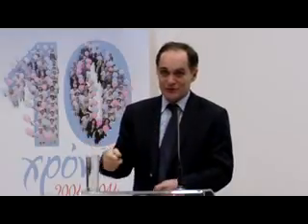Now, more and more, based on the studies of laparoscopy and major surgery, where you really remove as much as possible, you see that it improves. So now also with hysteroscopy, the size does not matter too much. A big cyst or a small cyst, for a myoma it matters a lot, but for the cyst not too much. And then we try to remove as much as possible also the deeper layer, but it's a little bit tricky. It's not standard surgery.